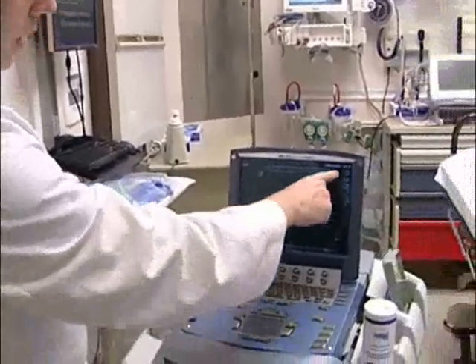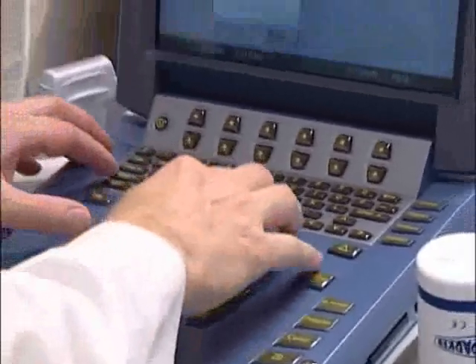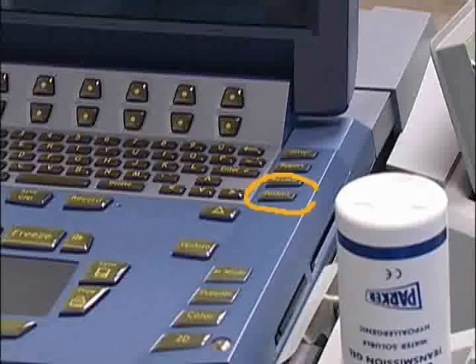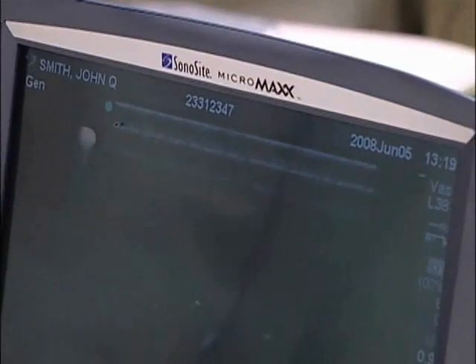Make sure that the correct date and time are shown on the machine. The patient's name should be entered by pressing the patient button. Enter the patient's name and MRN. When done, hit the patient button again, or the done button. You'll now notice the patient's name and MRN are on the image and will be preserved if the image is printed or recorded to the DVD recorder.